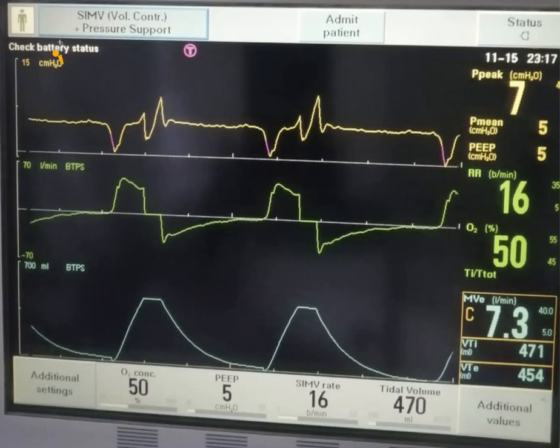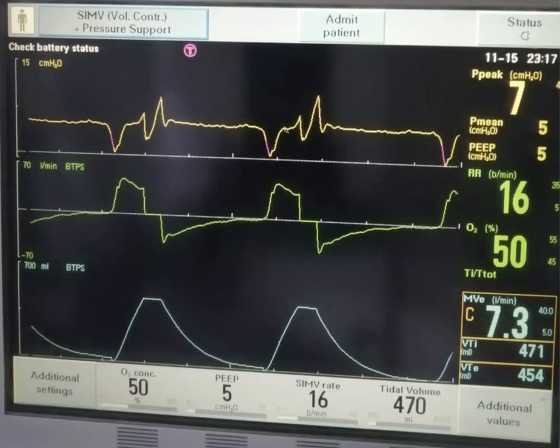This is SIMV mode of ventilation with pressure support. The set rate is at 16 breaths per minute, meaning that every 3.75 seconds there will be a mandatory breath. However, this breath can be synchronized with the patient's efforts, as we see here.